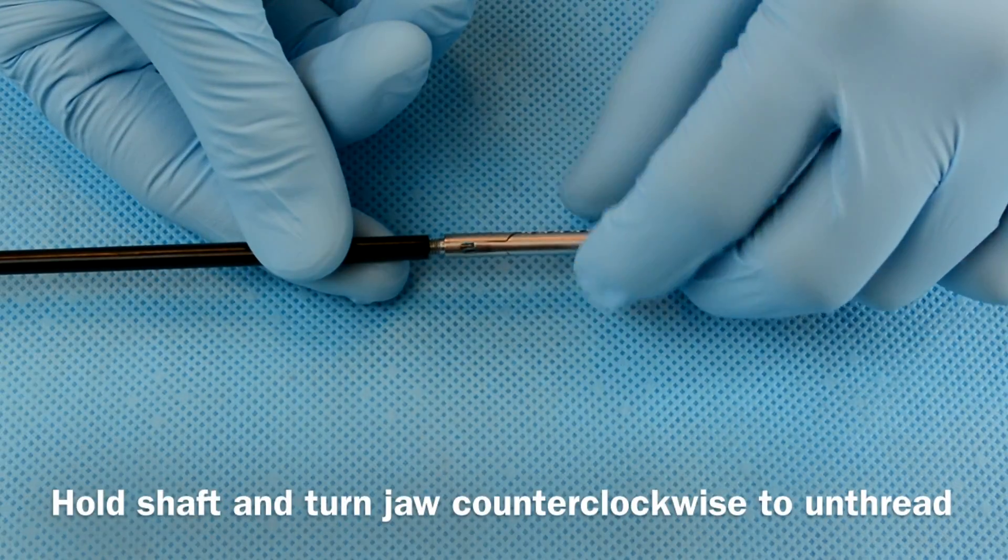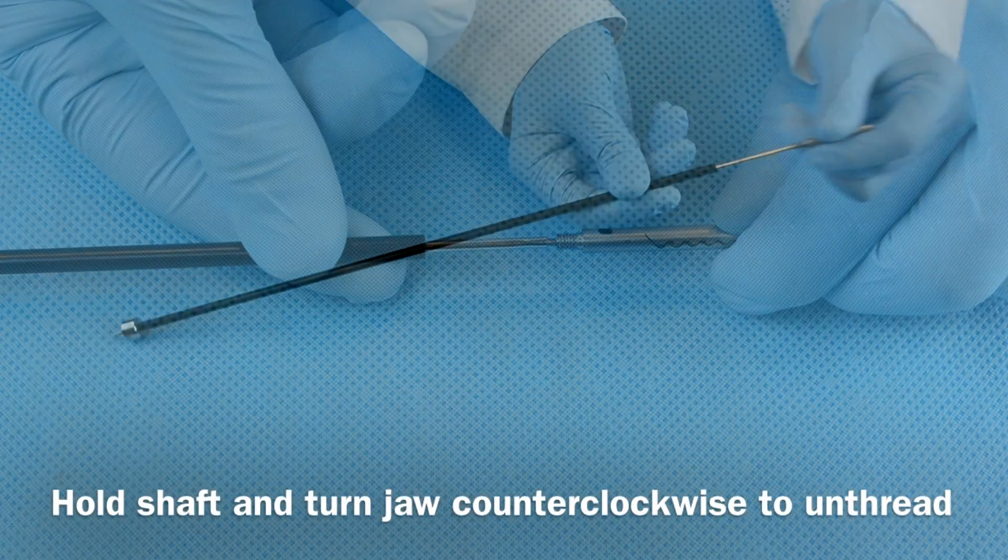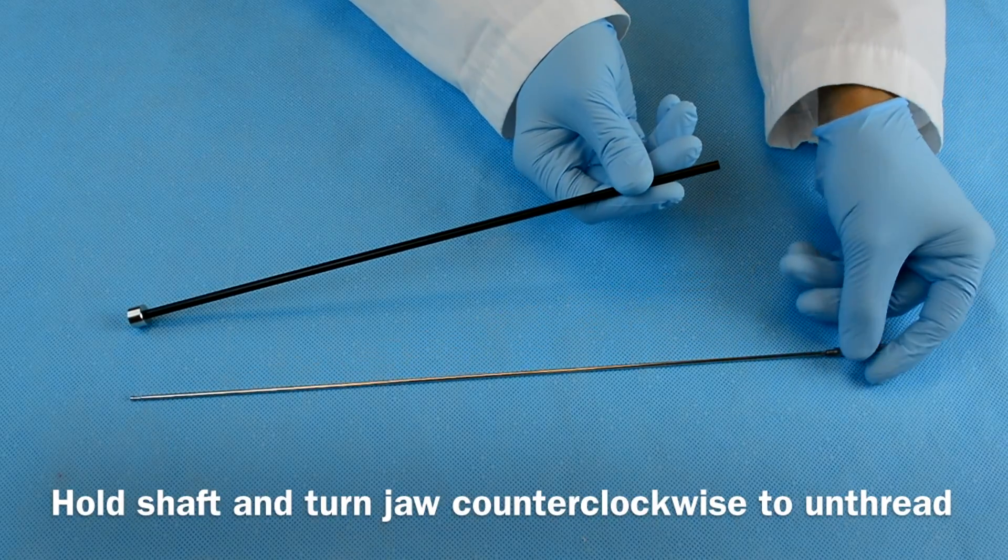Lastly, hold the shaft steady while turning the jaw counterclockwise to unthread it. Then pull the jaw out of the shaft.